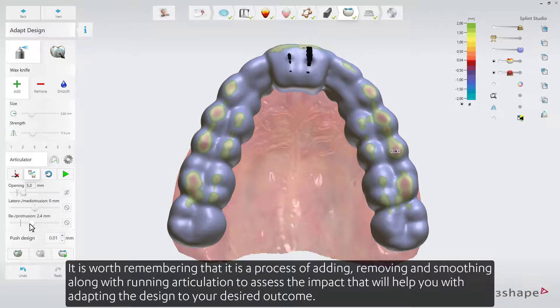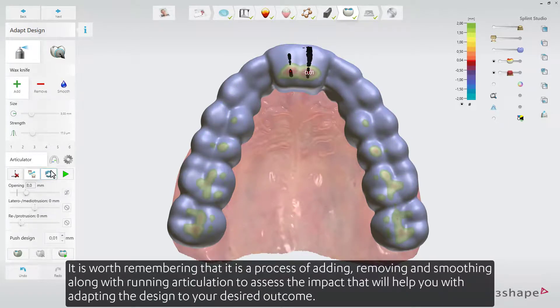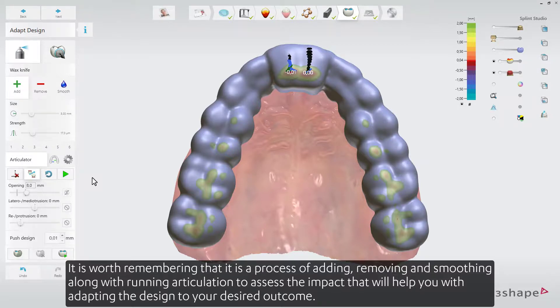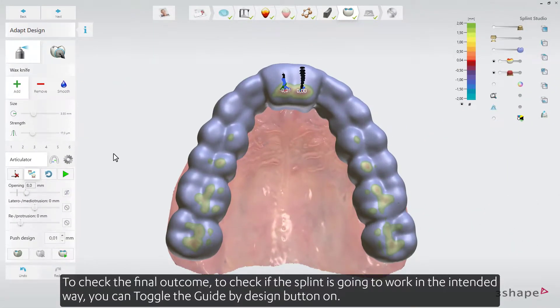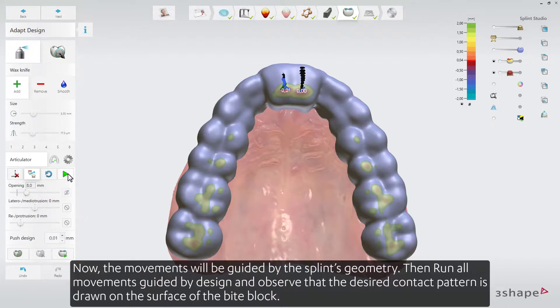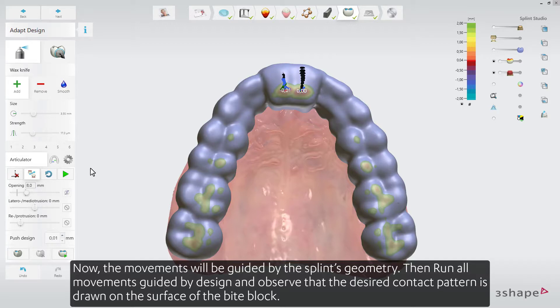It is worth remembering that it is a process of adding, removing, and smoothing, along with running articulation, to assess the impact and adapt the design to your desired outcome. To check the final outcome and verify the splint will work as intended, toggle the Guide by Design button on. Then run all movements guided by design and observe that the desired contact pattern is drawn on the surface of the bite block.